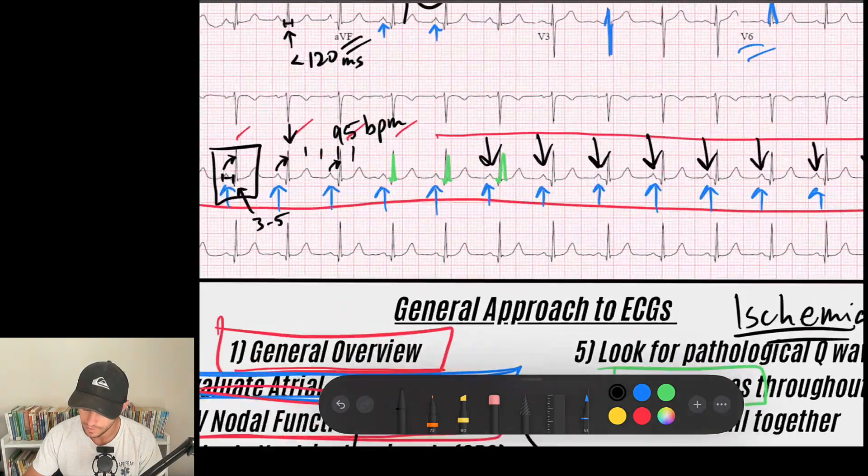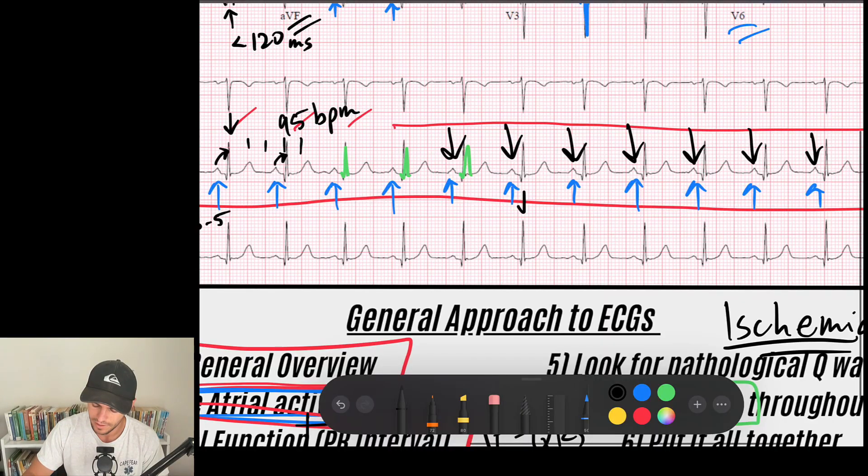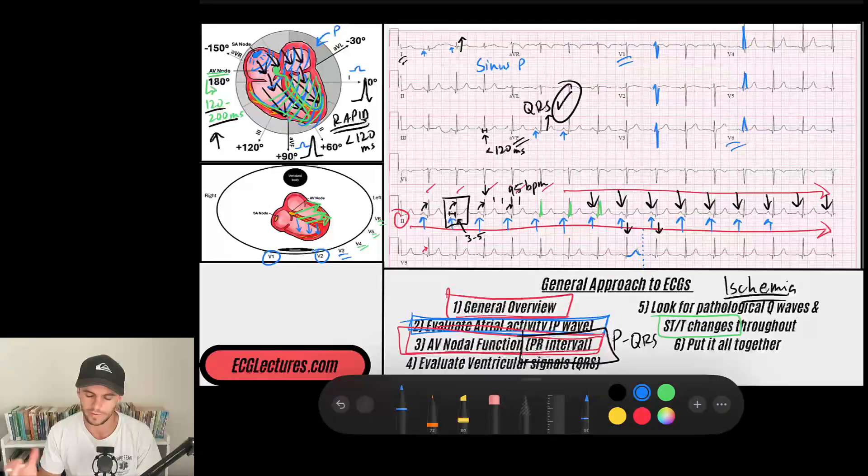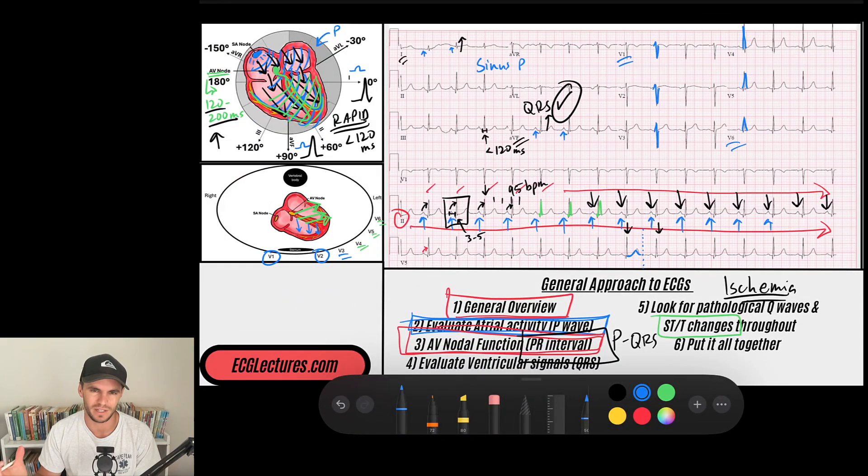So we're going to look at our QT interval. First thing I'm going to do is I'm looking at my QT interval. I like the eyeball test, meaning I find a QRS here, a QRS here. I know that if I draw a line midway through these QRSs, my T wave should end by the midline point, which it does. So that's my eyeball test for the QT interval because remember we have to correct it for the rate. It's a rate dependent interval. It's an interesting concept.